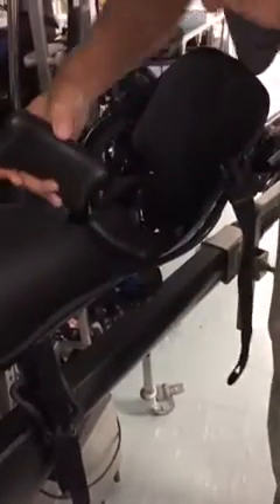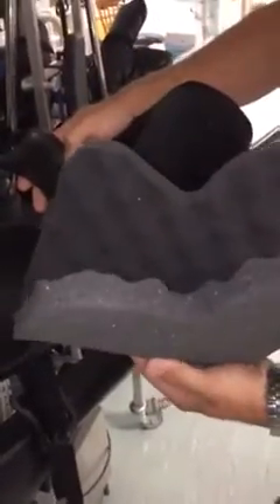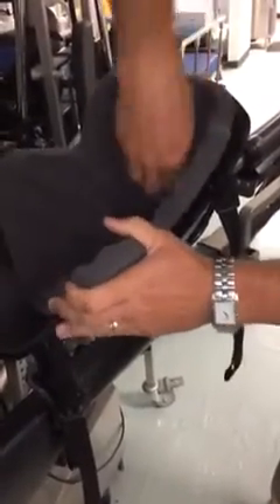Now I've given you a lot of information about what sizing to use. What I have with me is a small boot liner. Now I want you to see why we say we cannot use a small boot liner in an open boot design.